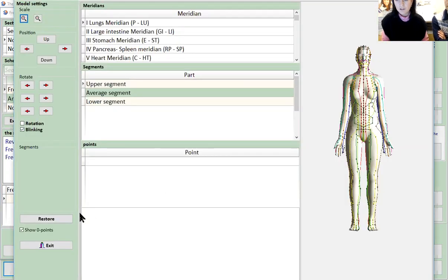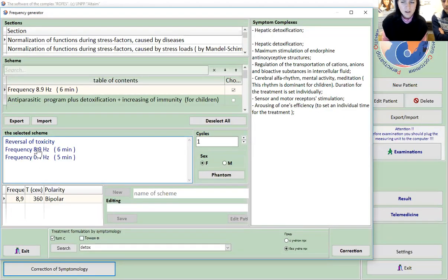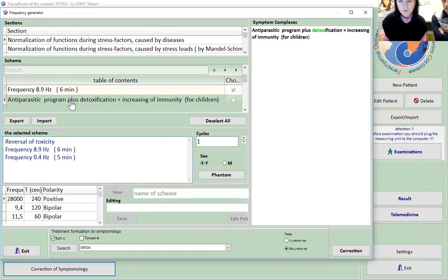When you do the correction, it will show you what points it is using. It's like every point on your body reacts to different frequencies. So basically they studied all these points and what frequencies they respond to. That's why we can say this frequency or that frequency. So whichever frequency we choose, they also correspond to a point on the body, if you understand what I mean.